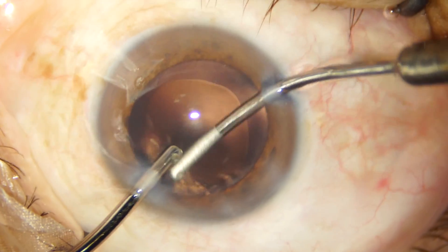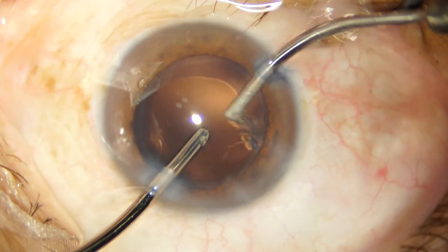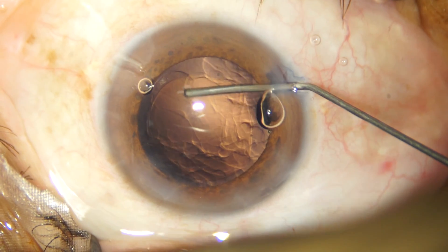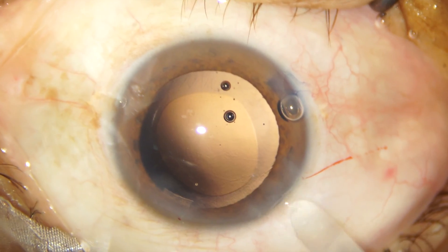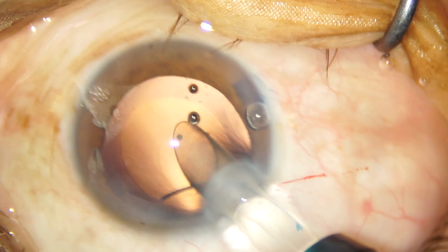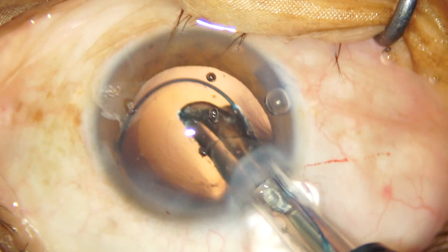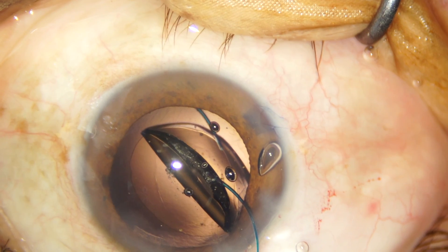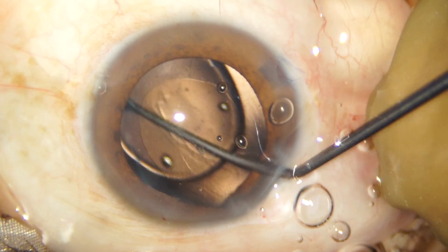Very few cortical fibers are left in the capsular bag and these are removed with bimanual irrigation aspiration. I am now injecting cohesive viscoelastic in the capsular bag to inflate it to its maximum, and we are implanting a 3-piece hydrophobic acrylic intraocular lens from Abbott Medical Optics. This is my go-to IOL because the OptiEdge technology and the 10-degree posterior angulation of the optics are very effective in preventing posterior capsular opacification.